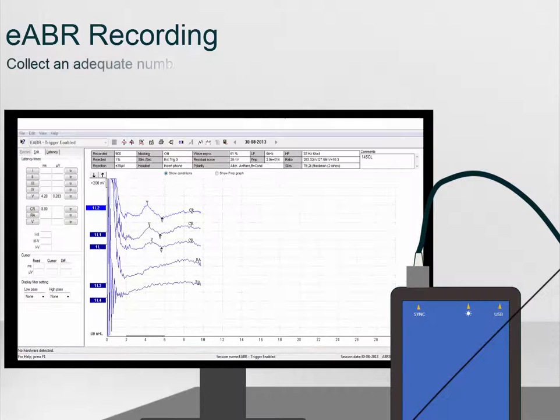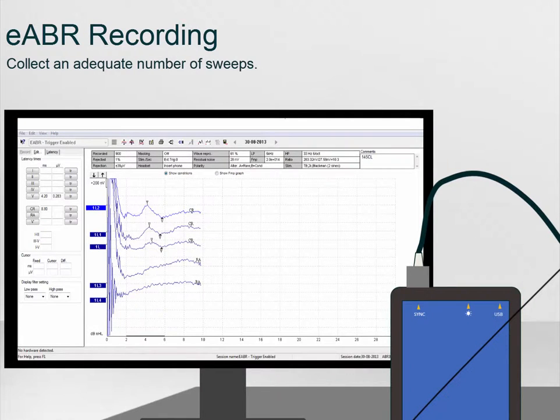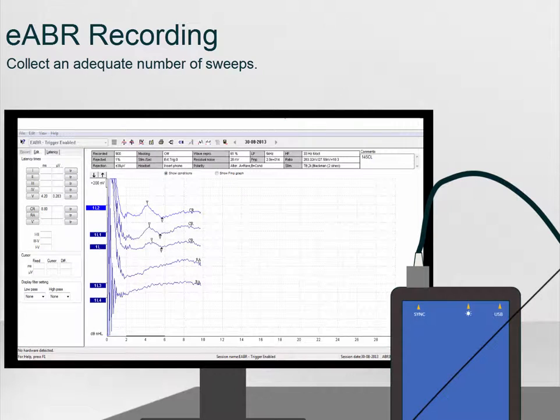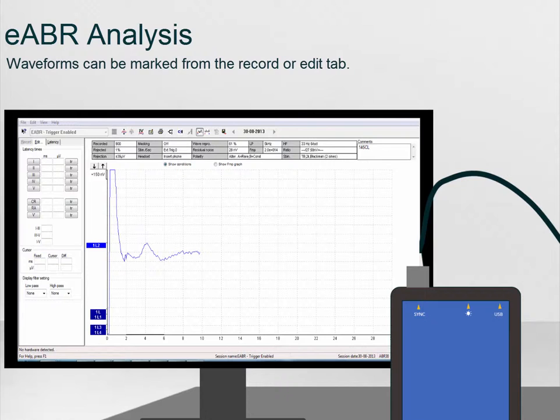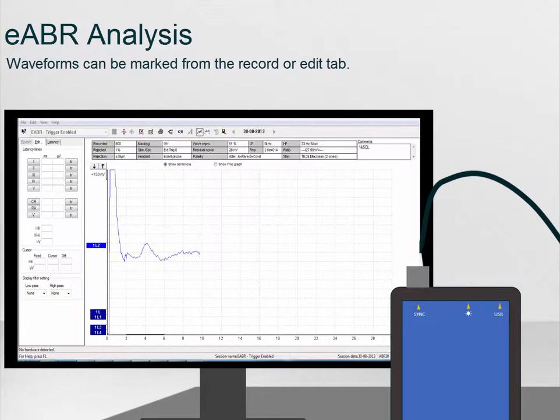Lastly, collect an adequate number of sweeps to see a clearly defined waveform. Once the eABR from one Cochlear Implant electrode band has been recorded, it is time to analyse the recording.